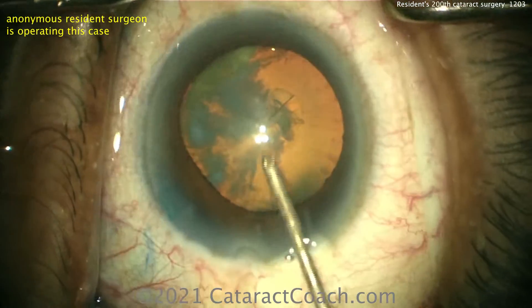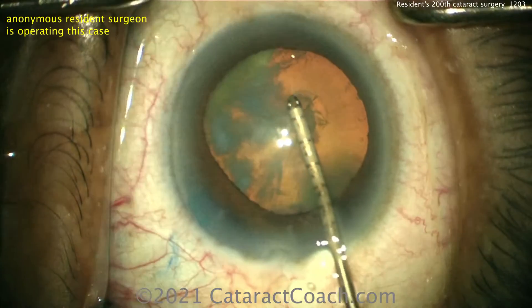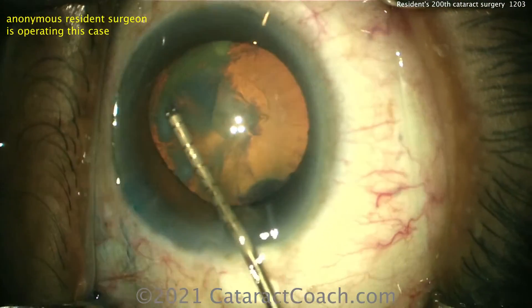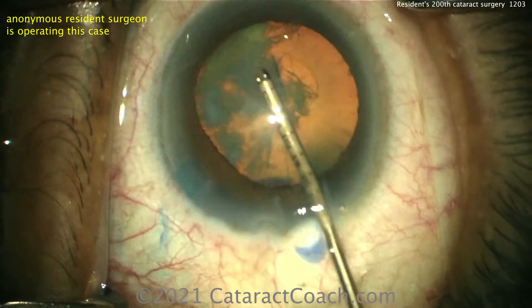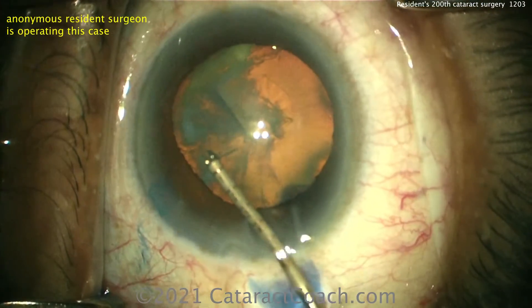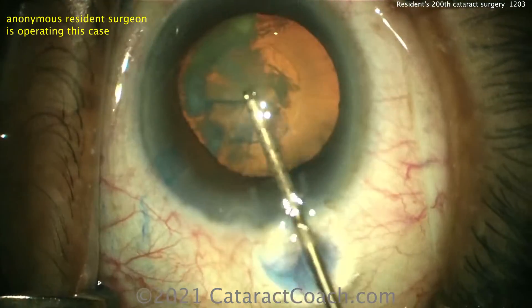Now coming to the forceps — fancy forceps here, some real micro forceps. These are helpful if you have a hard time with gaping of the incision. Starting the rhexis, and these forceps are also marked off at every millimeter, so you can get a good measurement.